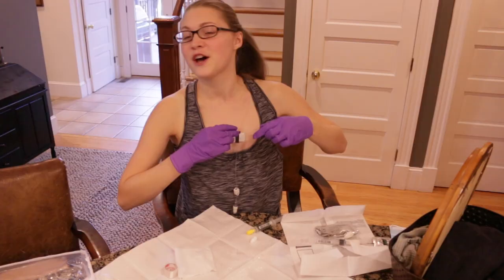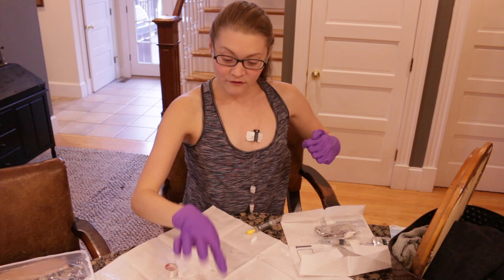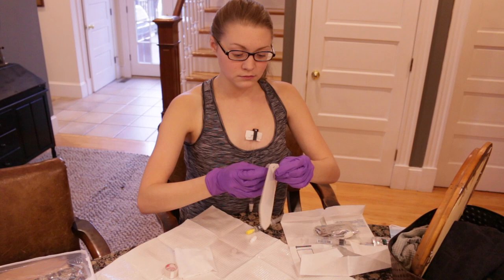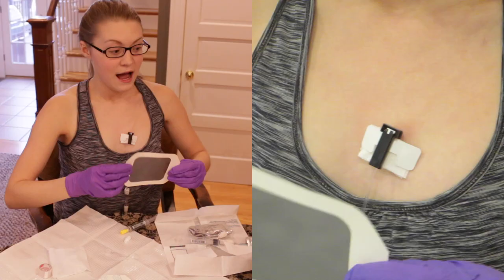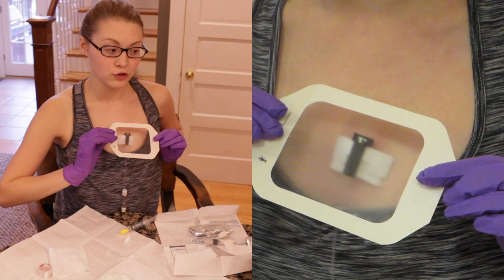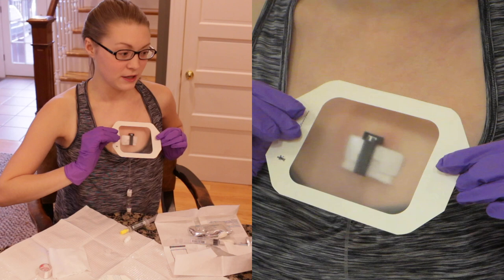I've got my gauze in place. I like my tubing to go pretty much straight down — sometimes I turn it to the side slightly. Looks good. I've got my dressing, and here's how I like to put it on: I prefer to have as little wrinkling as possible, except I do one strategic wrinkle at the bottom around the tubing. I slowly take off the backing — I use the clear Tegaderm, no gauze on the Tegaderm. I've found this one works best for me and my port and doesn't peel off too easily. I start at the top rim, lay it down first, work my way down, and then make that wrinkle around the tubing at the bottom. This could get a little tricky with my shirt, but if you are by yourself, it's probably easiest to wear a shirt that wouldn't interfere with the dressing.